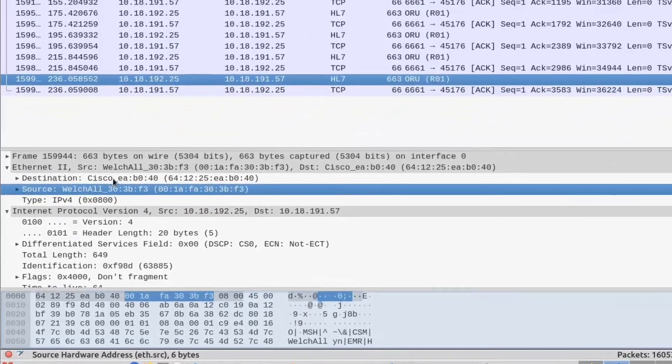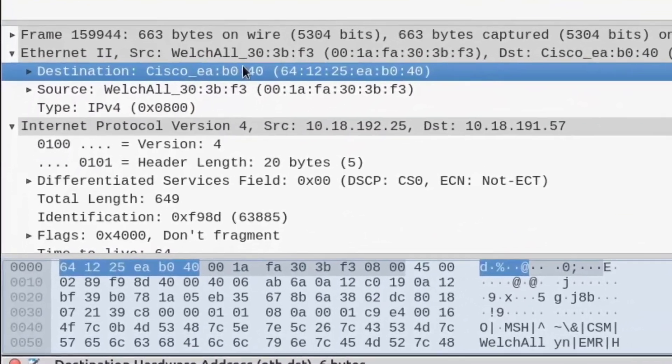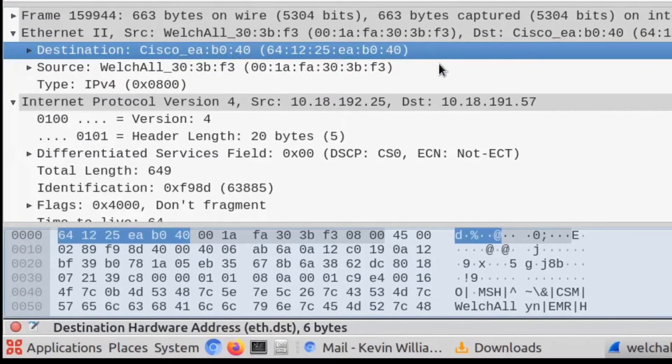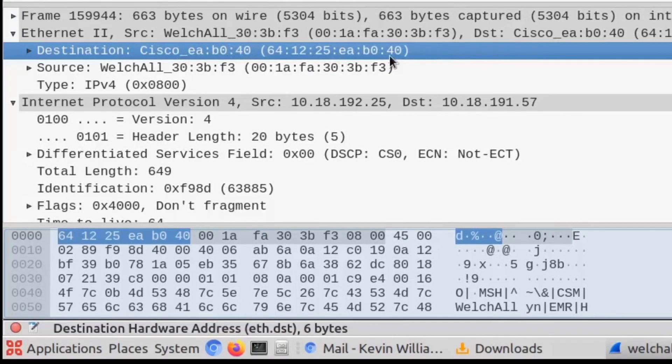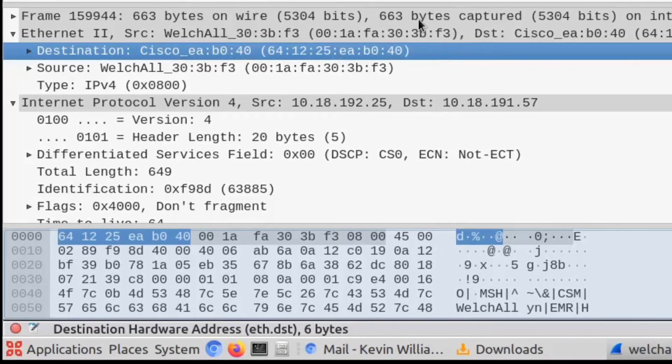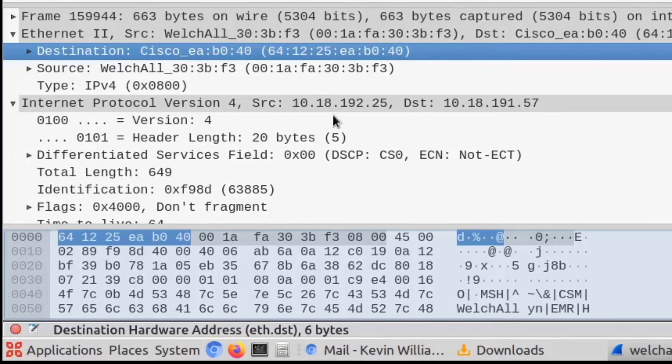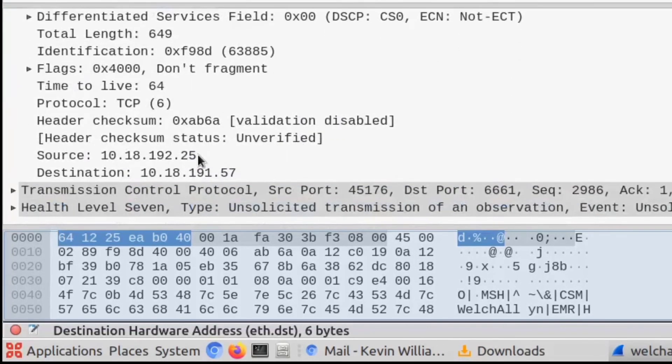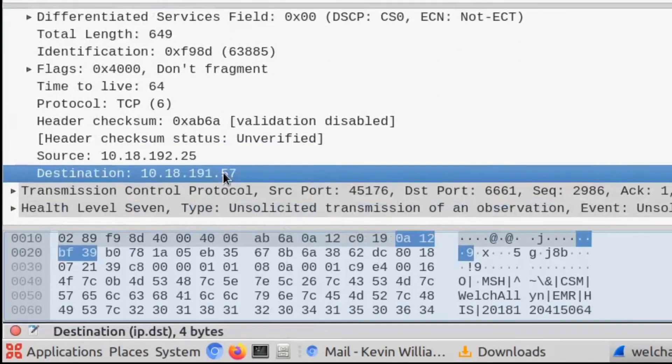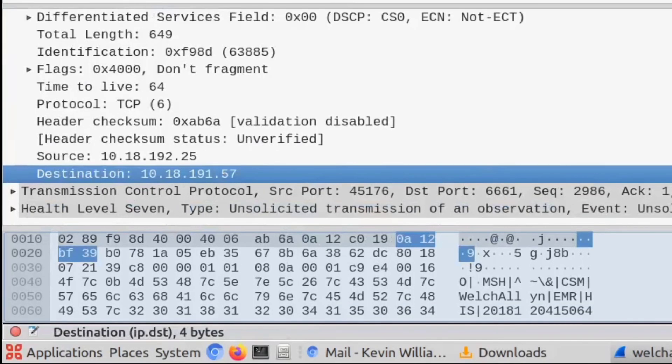It also gives you insight into some other kinds of information. You can see here we have the source and destination of this packet, the source being the Welch Allyn and the destination most likely being a switch in the network. But you can also see the source and destination IP addresses for this packet.